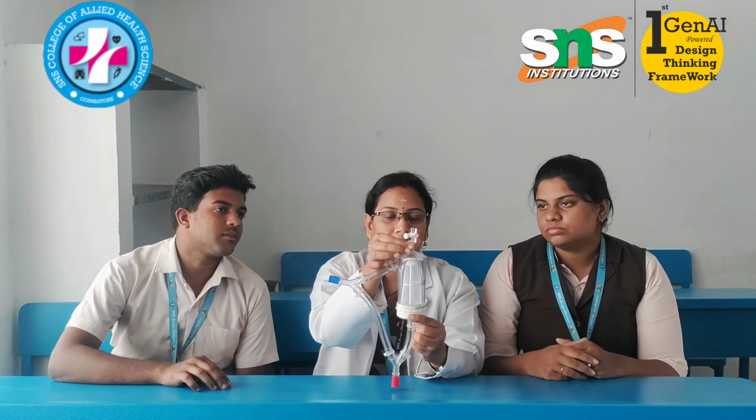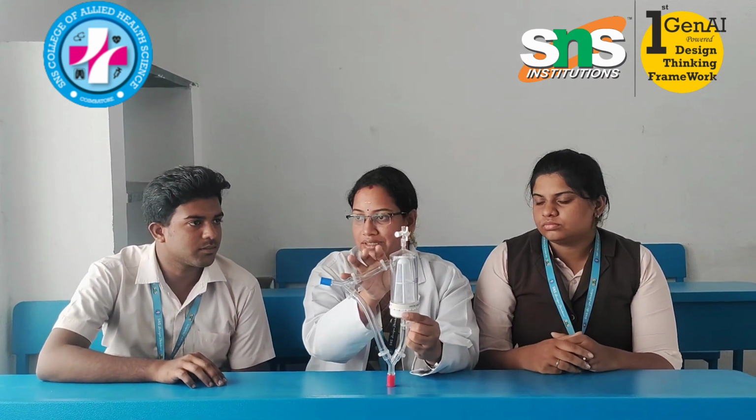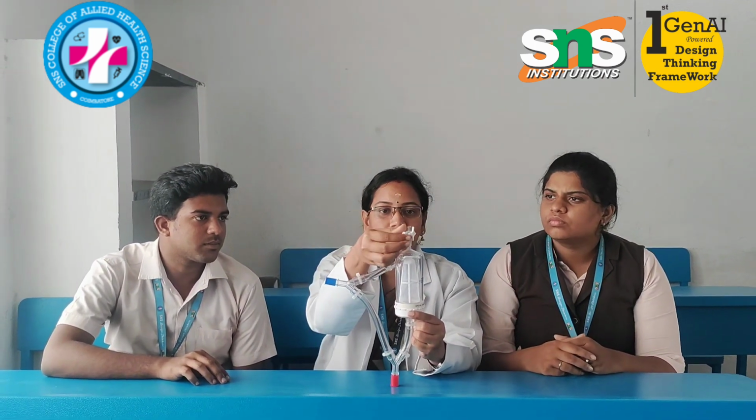The purpose of the purge is to remove air. This purge has to be running while on bypass. If your pump stops, or you are stopping the pump, you have to clamp or stop this purge line. What is the reason for it?